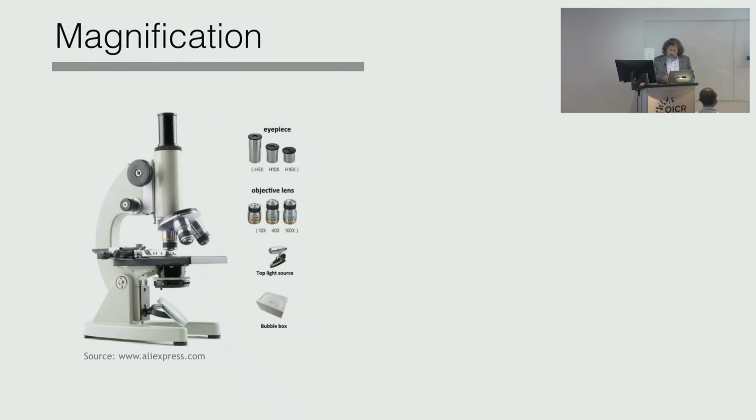Magnification is a point. I was just struggling up to yesterday, in such a short time, what topic should I put here? Just when we talk about digital pathology, magnification is a sticky point.